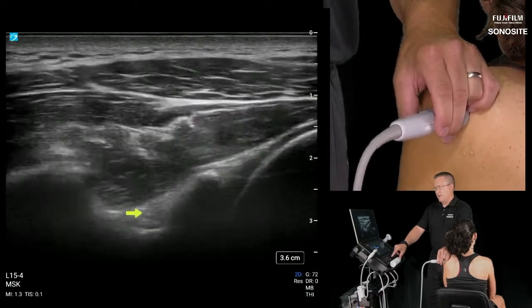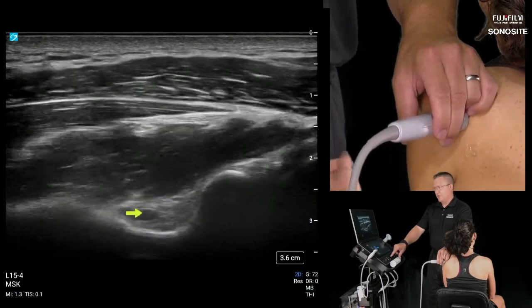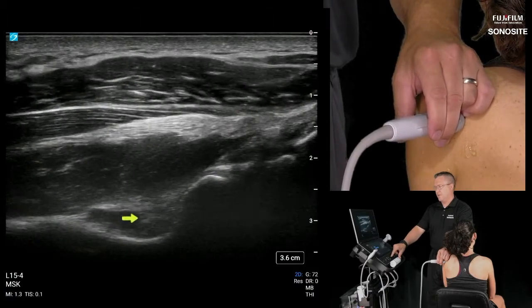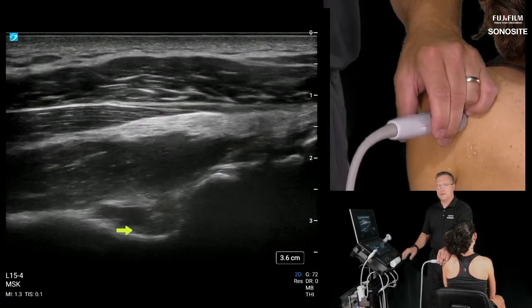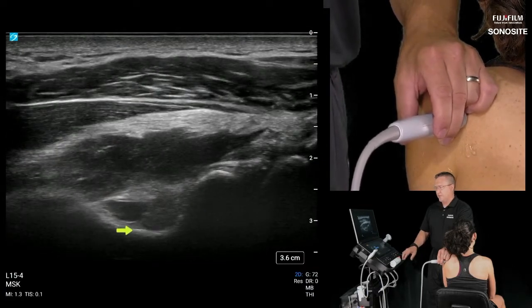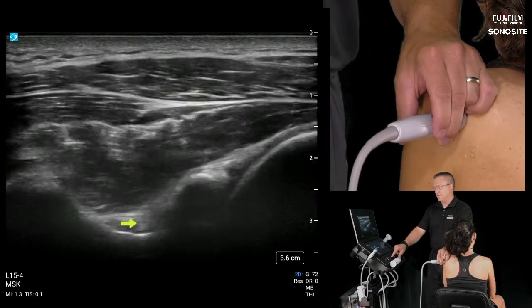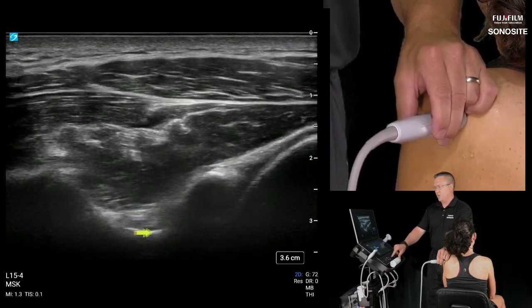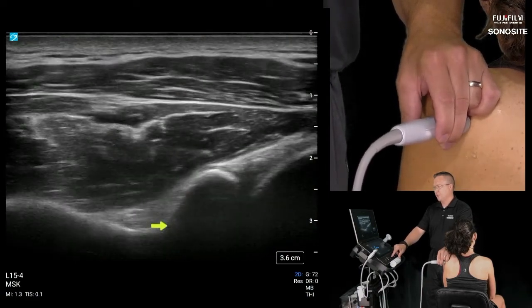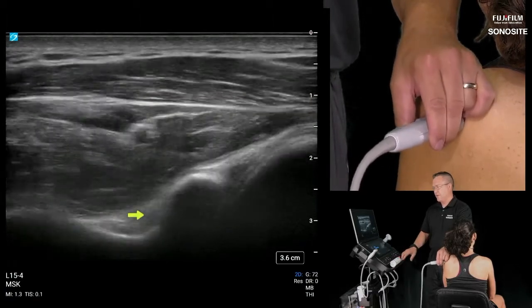If they're already in an external rotation, let's say, go ahead and externally rotate and just hold it, and you're doing this exam, and you fall into that spinoglenoid notch, don't call this big hypoechoic structure a cyst. This is not a paralabral cyst at this point. It's just that dilated vein. And certainly don't throw a needle in there. Go ahead and relax, and you'll see that vein collapse. So just know that that is where we're looking for the posterior suprascapular nerve back here. There are those other neurovascular structures in the area too.